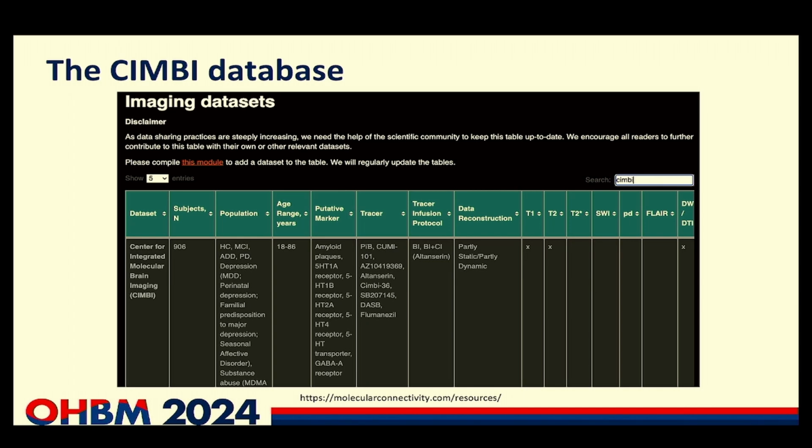Or, when you say types, do you mean isotopes, for instance? You mean isotopes? Yeah. Sure, it's different systems you look at. I was more thinking of, if you have the same tracer, different sites, you can combine them. Of course, they're from different scanners, so you have to take that into account as well. Sure. But that's a whole other issue.